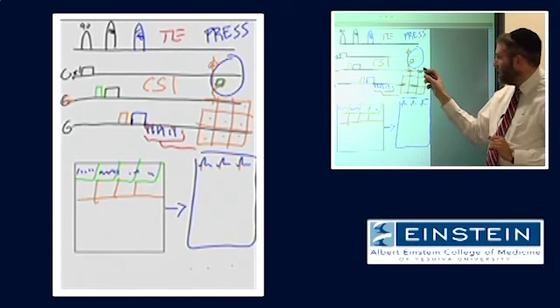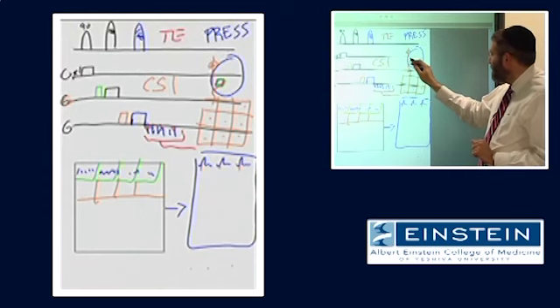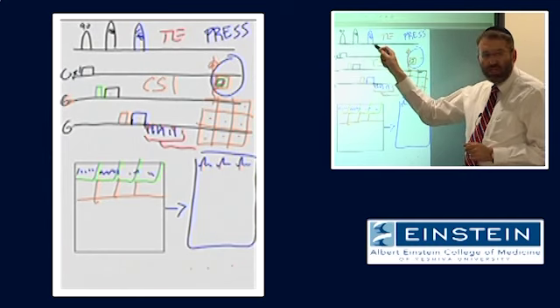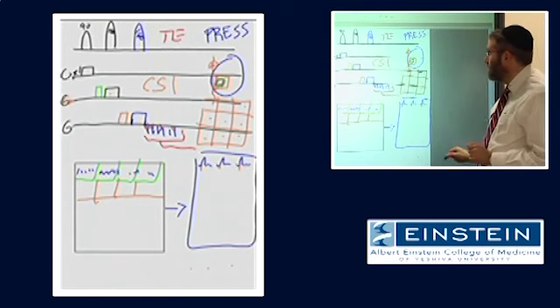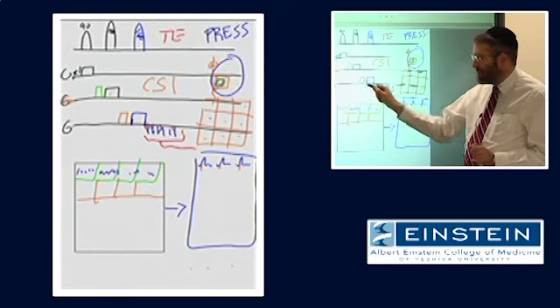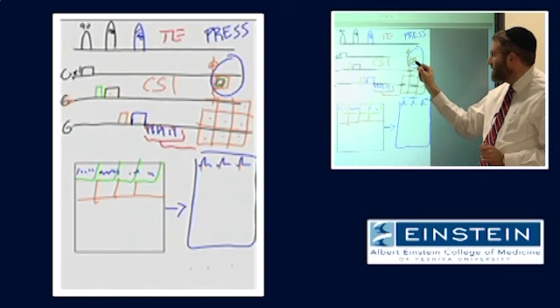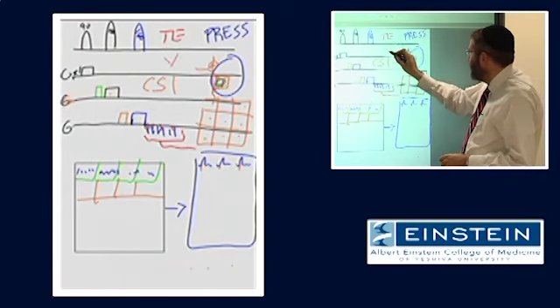So notice that in this case of chemical shift imaging, though, it's a specific volume of tissue that we've initially defined. That's based on the three slice select gradients for our three successive RF pulses. It's the extra applications of some of those gradients that allow us to encode the information so we can separate its locations within that volume. And this area is typically called the volume of interest.